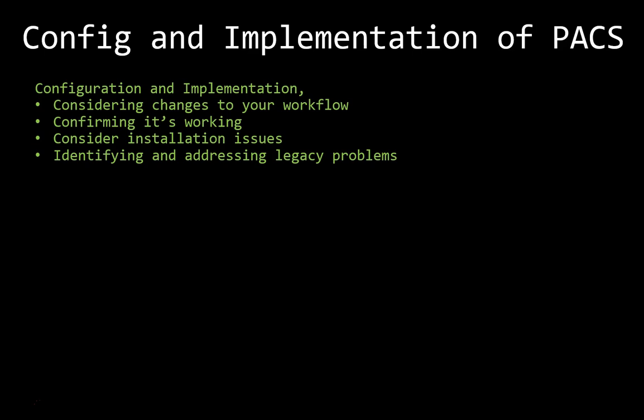Legacy problems should not be significant for this type of install. You just need orders and images in, and possibly results going out if you are using an enterprise PACS system.